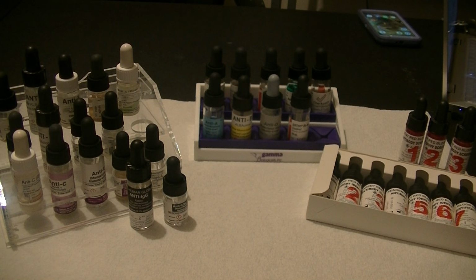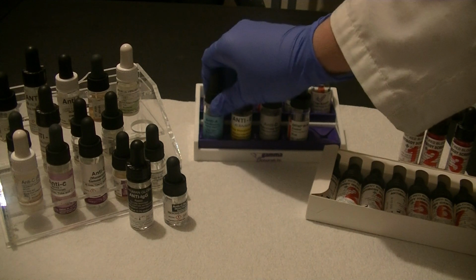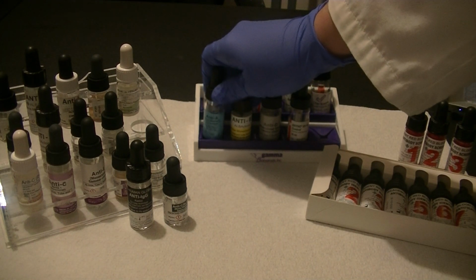Chapter 3 is all about reagents that are used in the blood bank. You'll notice on slide 4 in Chapter 3's PowerPoint presentation that there are 4 different types of reagents that we use in the blood bank lab. The first type is anti-sera. Anti-sera means antibodies in a bottle.